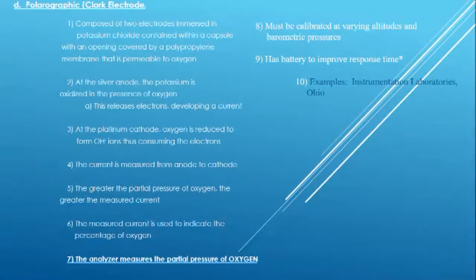Polarographic is known as the Clark electrode. The Clark electrode. For some reason, when I was in school, I thought about Clark Kent, Superman. Somehow I tied it with the Clark electrode, okay? Because I was talking about air or whatever. I don't know, but that's how I remembered it. So the polarographic, this is how it works. It's also composed of two electrodes immersed in potassium chloride contained within a capsule with an opening covered by a polypropylene membrane that is permeable to oxygen.